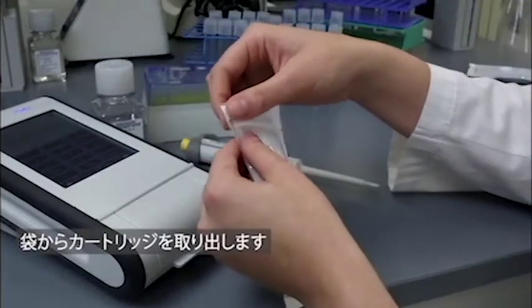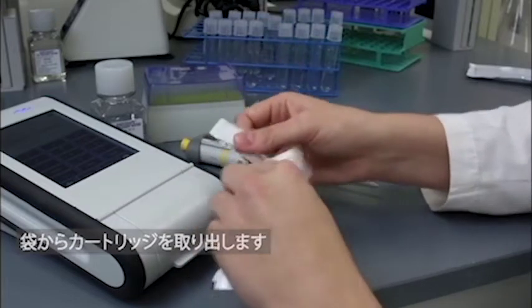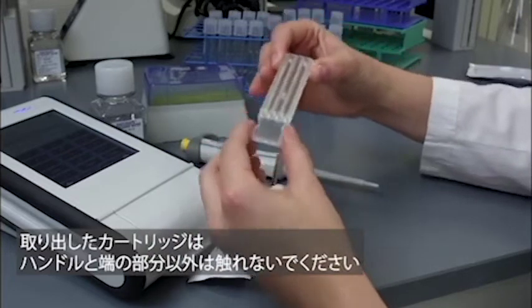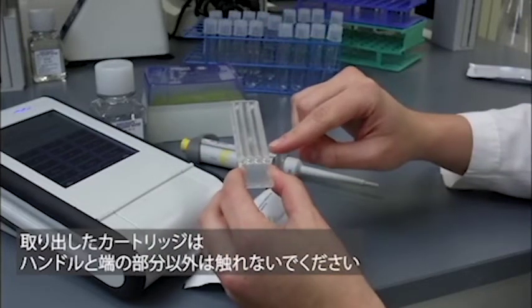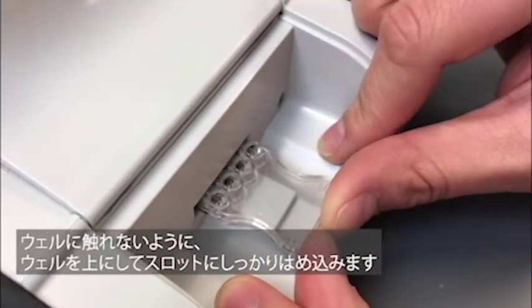Remove your cartridge from its pouch. Take care to touch only the handle or edges of the cartridge. Once the cartridge is fully removed, touch only the handle end of the cartridge, not the sample wells, and place it firmly in the slot of the reader with the wells facing up.